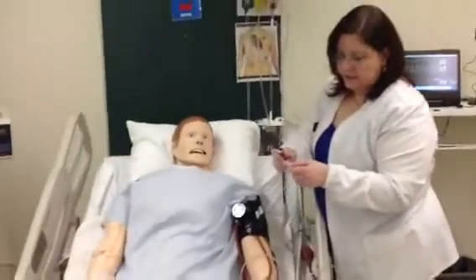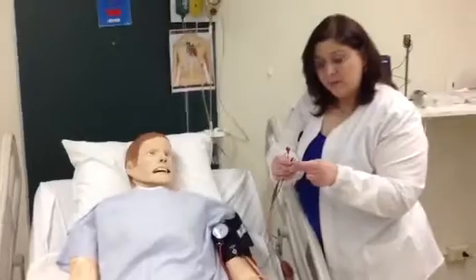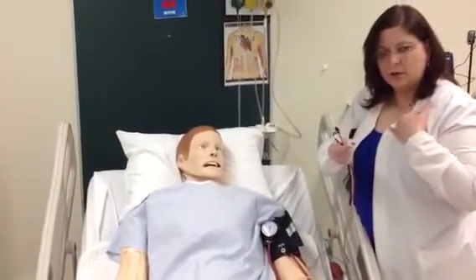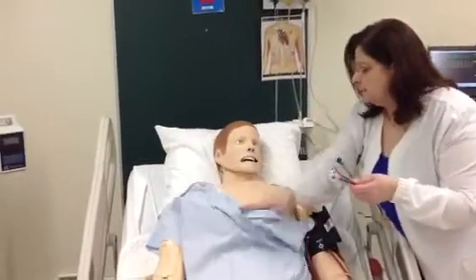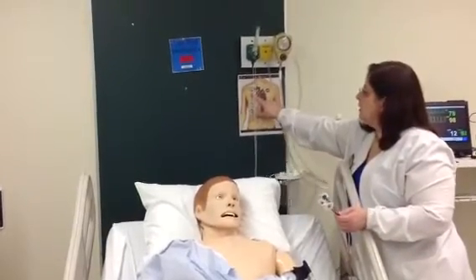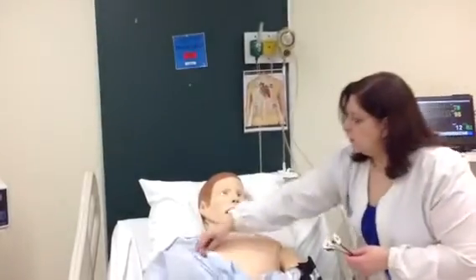Get a couple of the leads from here. I like to put the leads on these buttons before I put them on the patient, because it can hurt to push these on. So you would pull back the gown. You can use the little cheat sheet that I put here. White is on by the right arm.